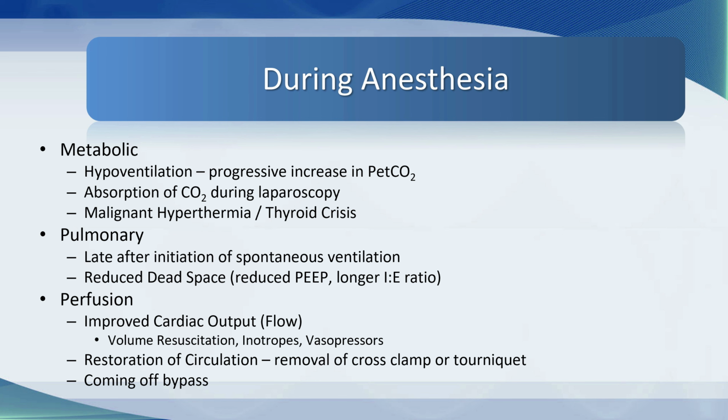of good clinical practice. And of course, the third reason why the end tidal might rise during anesthesia is just improved overall global hemodynamics, improved cardiac output, improved flow from volume resuscitation, particularly with blood, or the administration of inotropes or vasopressors. Remembering that induction of anesthesia is associated with a dramatic increase in the unstressed blood volume, and because of that, the flow to the lungs will reduce, and the end tidal may well be lower than it should be. And once you give the patient some vasopressors, like for example phenylephrine, the blood flow in the stressed circulation improves, and this improves overall global hemodynamics, and as a consequence of this, the end tidal CO2 will rise.